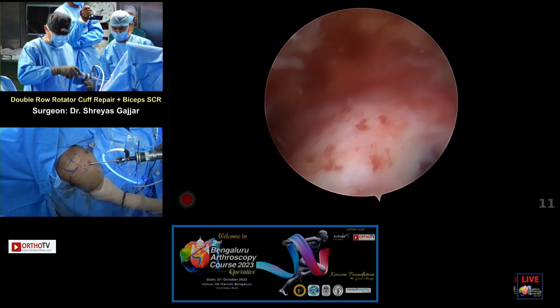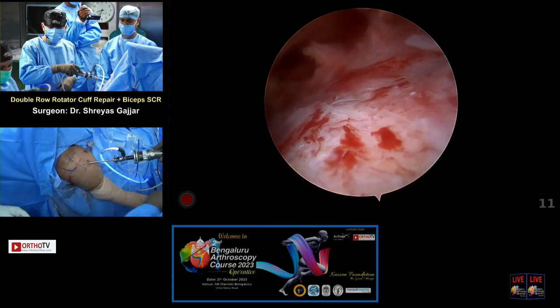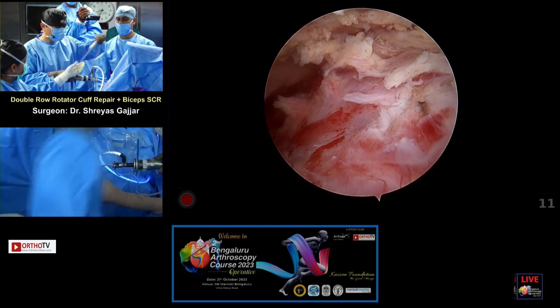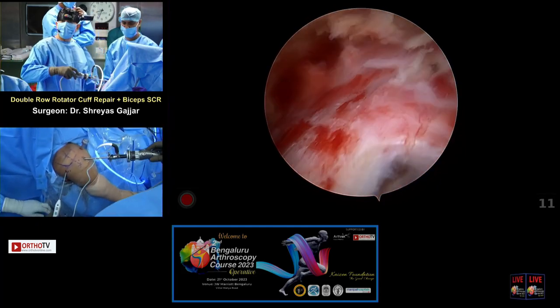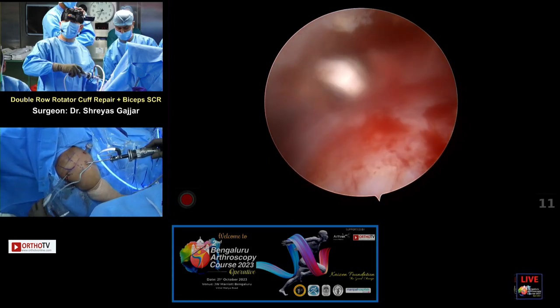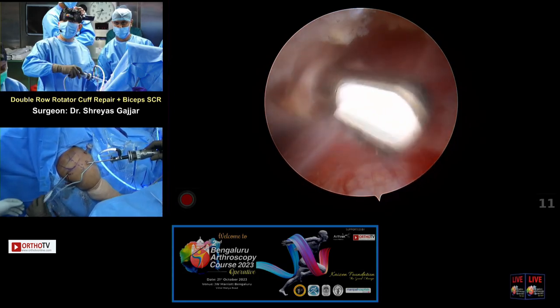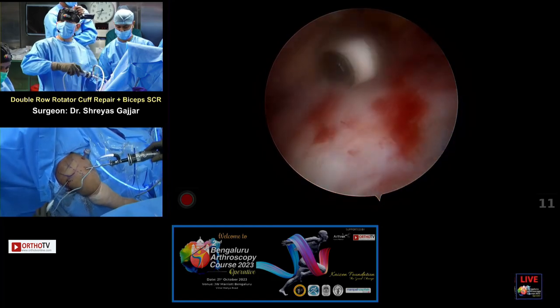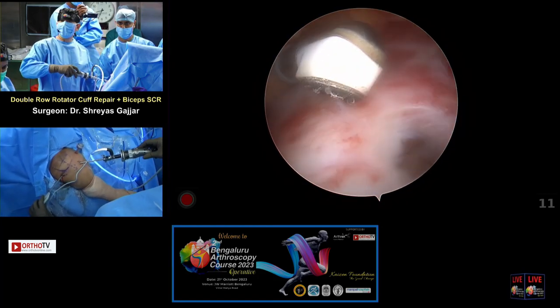Okay. Can I have the RF, please? You can put it back there. Thank you, sister. So basically, you view from the lateral portal and work through the posterior portal. Once I have to repair the cuff, I have a viewing portal laterally, and I'll work from the anterior lateral and the posterior lateral portal, depending on the pattern of the tear.